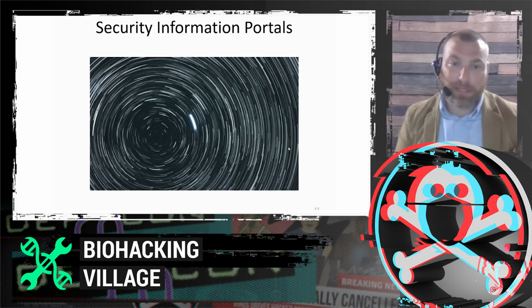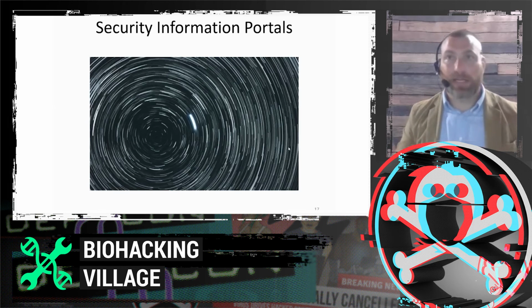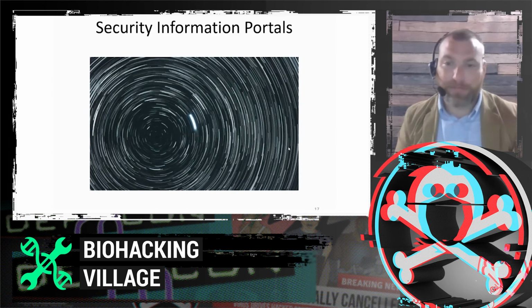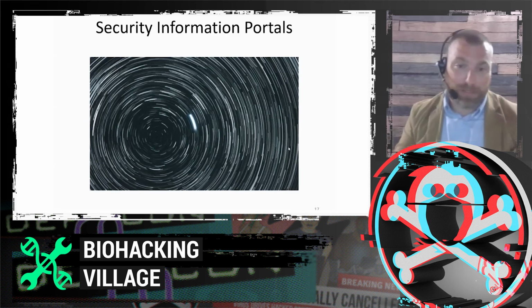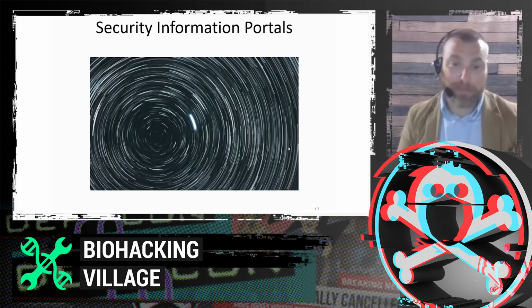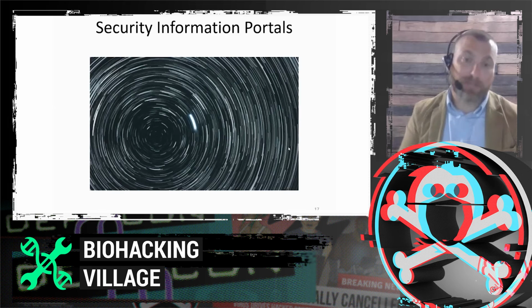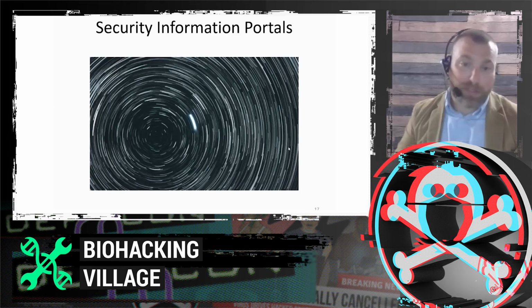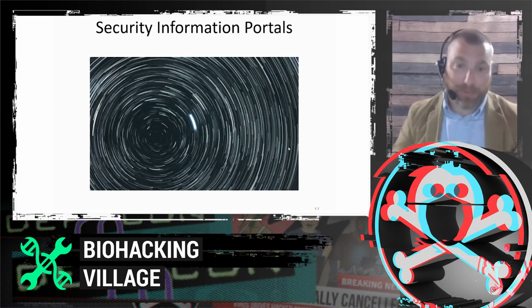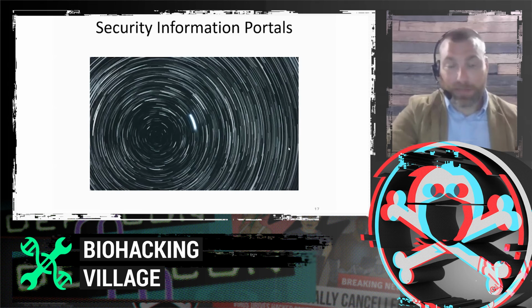There have been some industry attempts to have all of that information centralized in one place, but those have either faltered or haven't really caught on. So maybe we'll get there eventually, but in the meantime, for a good number of manufacturers, you can at least go to one place and get all of the information that you need. As I said, SBOM, MDS2, white papers, installation guide, any other information, hopefully in that one place to make it a little easier for you.